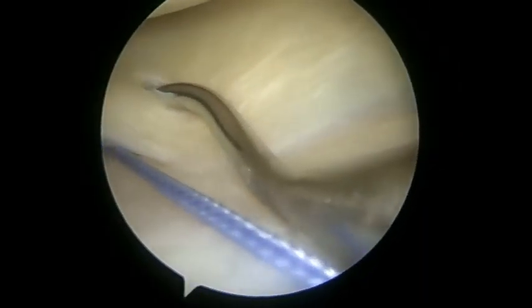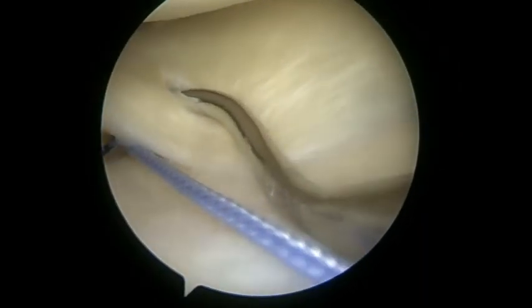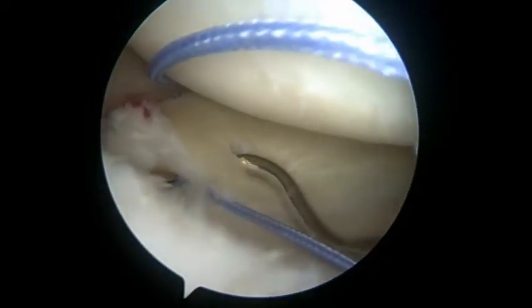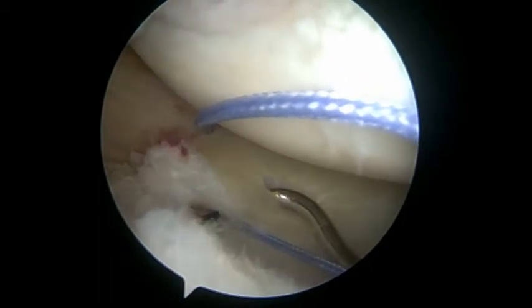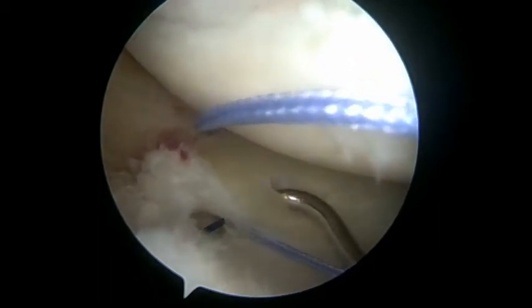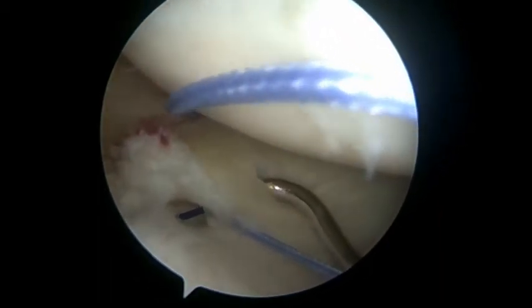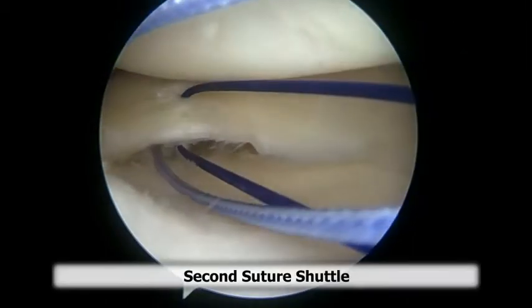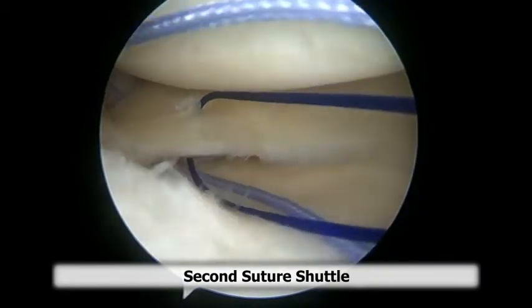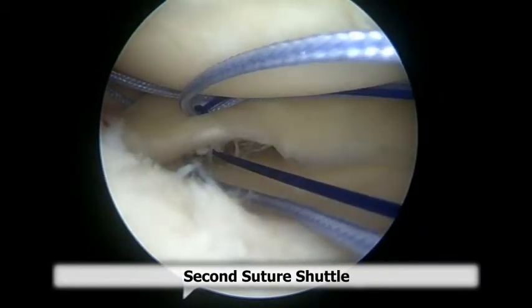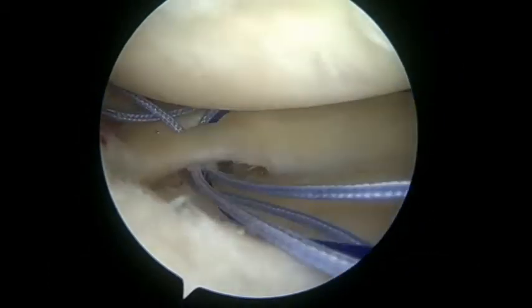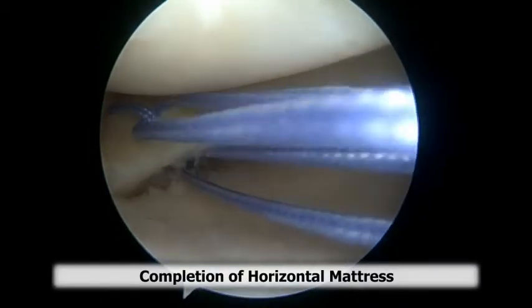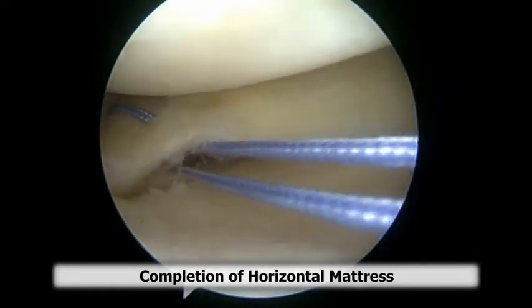We then prepare to create our horizontal mattress by shuttling a PDS through the meniscus more centrally. This is grasped and pulled out of the medial portal similar to the first PDS. The superior limb of the PDS is tied around the superior limb of the suture, and we pull on the inferior limb of the PDS, bringing a horizontal mattress stitch through the meniscus.